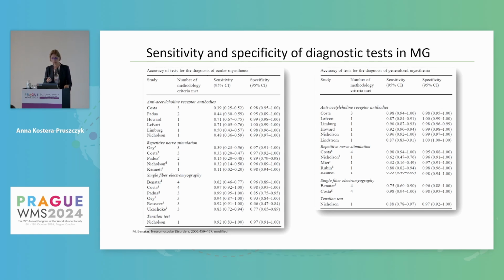When we employ any of the electrodiagnostic tests in the diagnosis of neuromuscular junction, or myasthenia or myasthenic syndrome patient, we really have to be aware of the sensitivity and specificity of the test that we choose. It will really depend on whether we test the proximal or facial muscles, orbicularis oculi muscle being one of the best to be tested, and what is the specificity of the test.